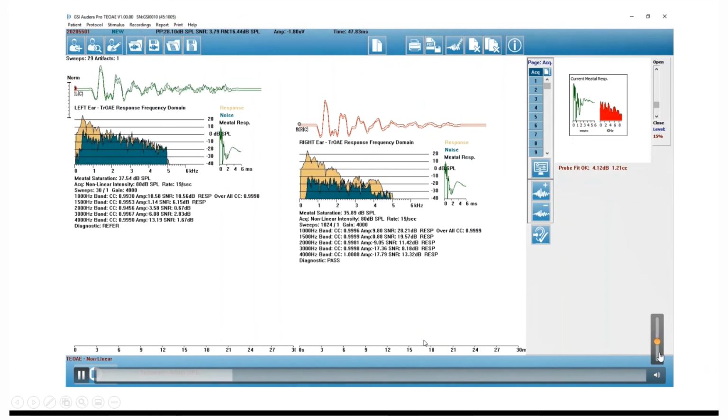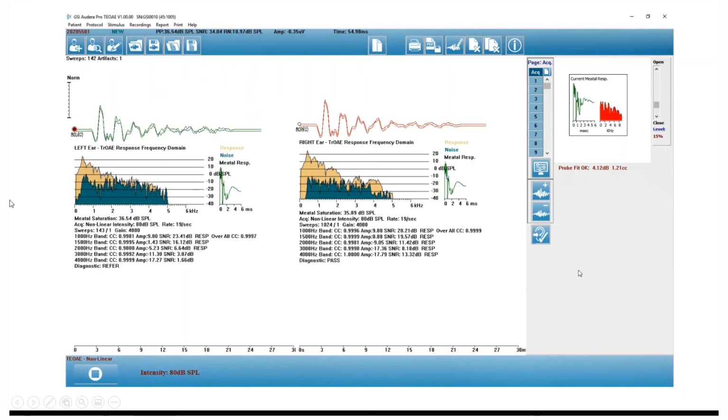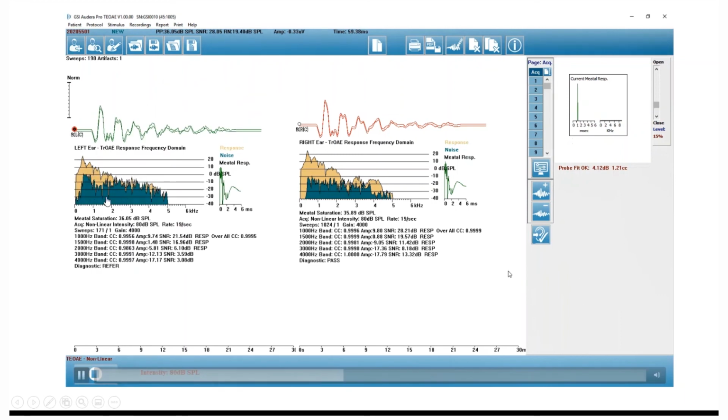You're going to see the left results appear there. I can move those down so they're equal to the right ear. Remember, green is noise and yellow is the response. Down at the bottom here you can see the frequency bands, amplitude, and the signal to noise. To pass a frequency, the signal-to-noise ratio would have to be 6 dB.